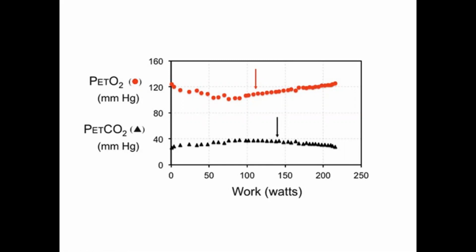The reason why I'm spending time on this is that the ventilatory threshold is an important thing to recognize, because if it happens, it's important where it happened. If it doesn't happen, it tells you very useful information as well.